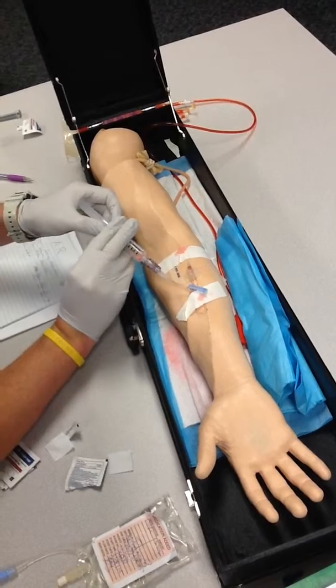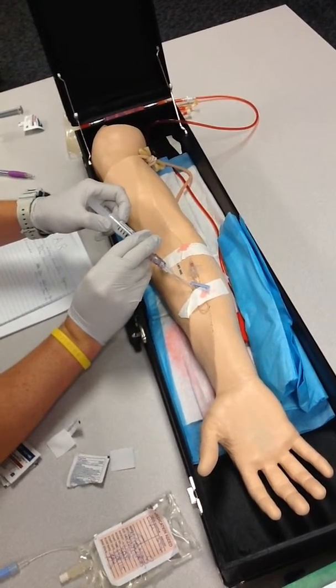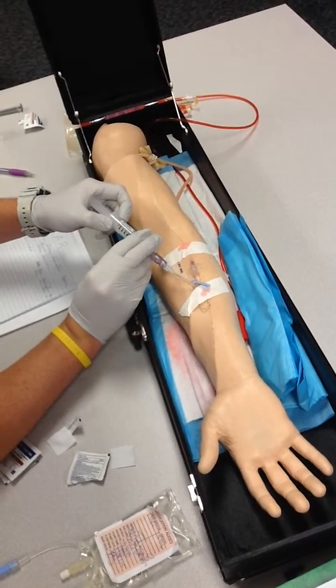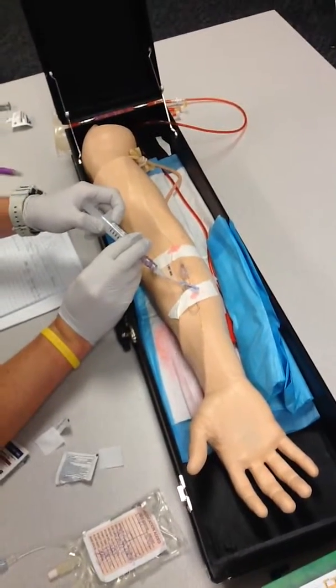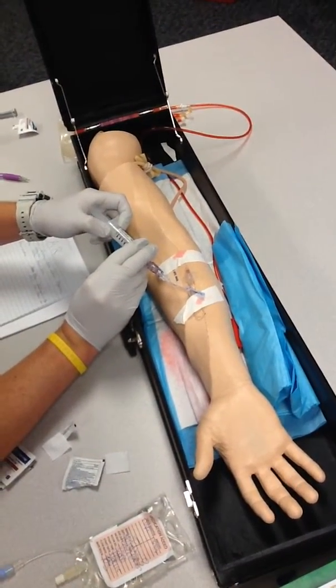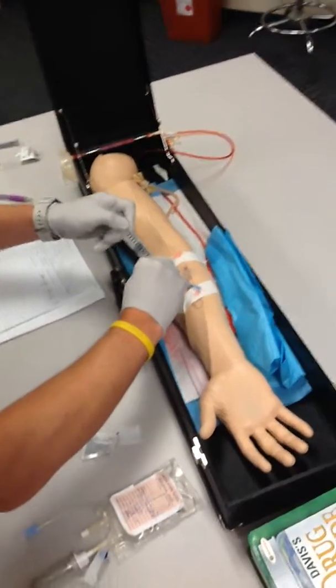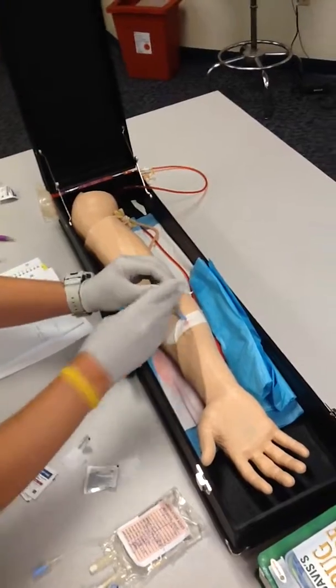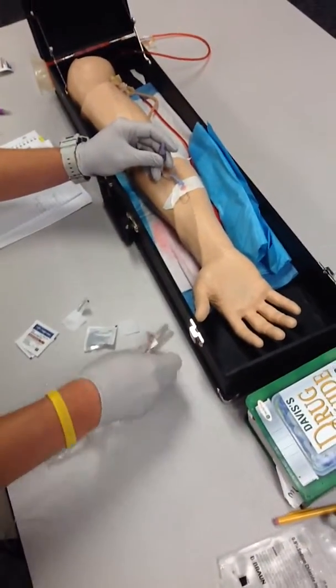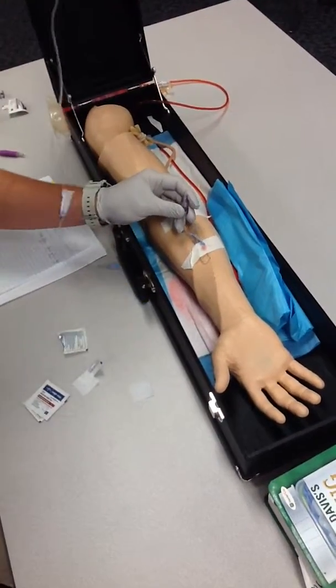So I will start to administer the flush at the push-stop method of 0.5 milliliter per push. Alright, 3 milliliters of saline have been flushed through. Next we'll have our Minibag application.